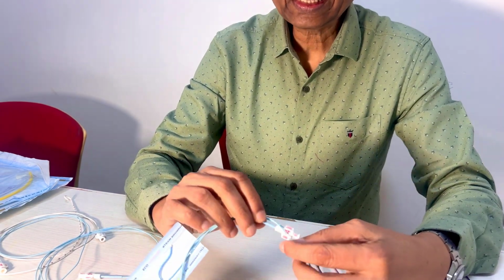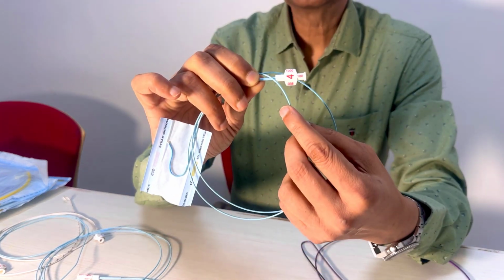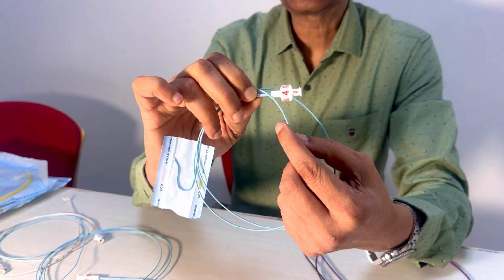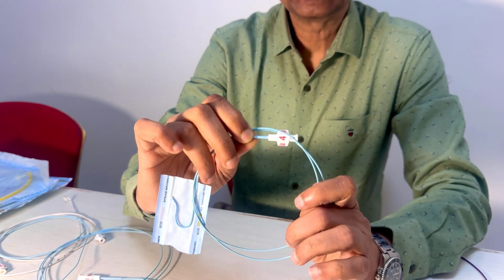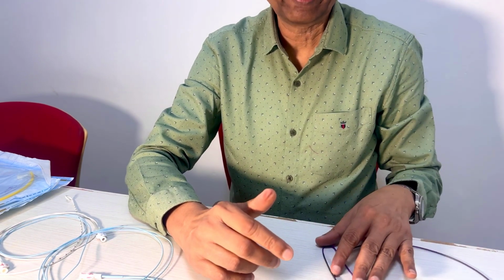And the last thing that you look at is 1200. What is that? 1200 is the burst pressure of the catheter, or the pressure at which you can inject contrast through an injector. It is 1200 psi, pounds per square inch. You understand that very well? It's important that you understand these fundamentals. Once you're used to a catheter, you don't have to look. But otherwise, when in doubt, look at a catheter. Like I said, there is a lot of information at the hub of the catheter.